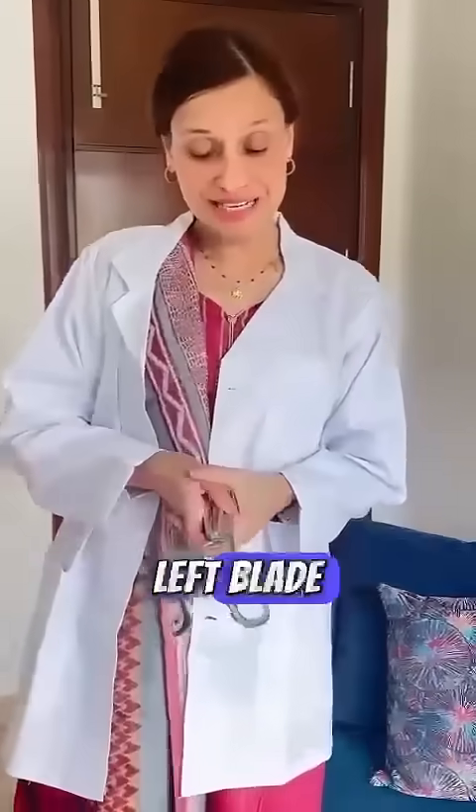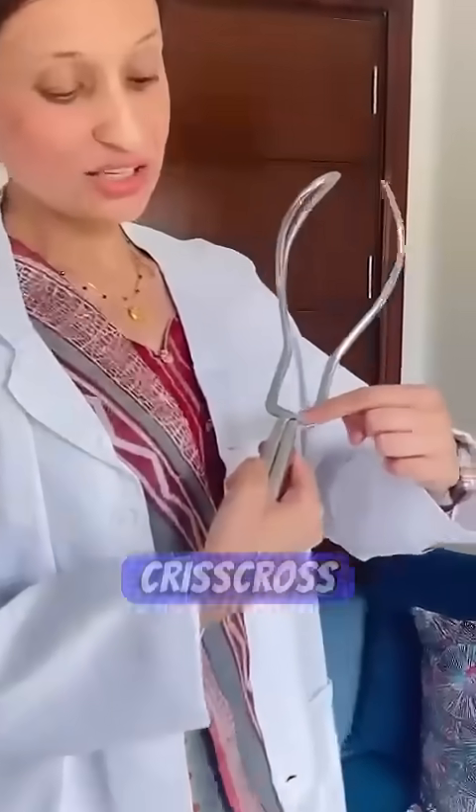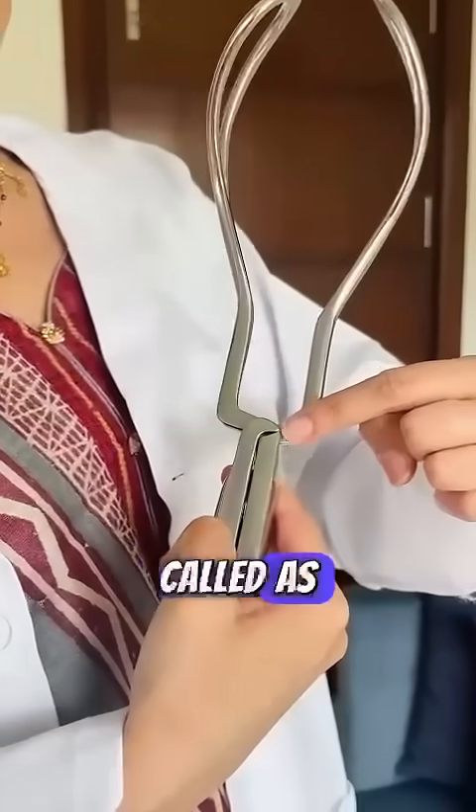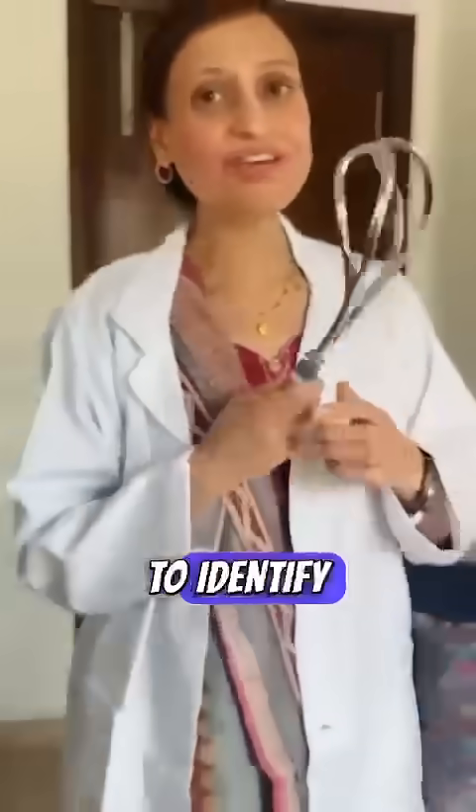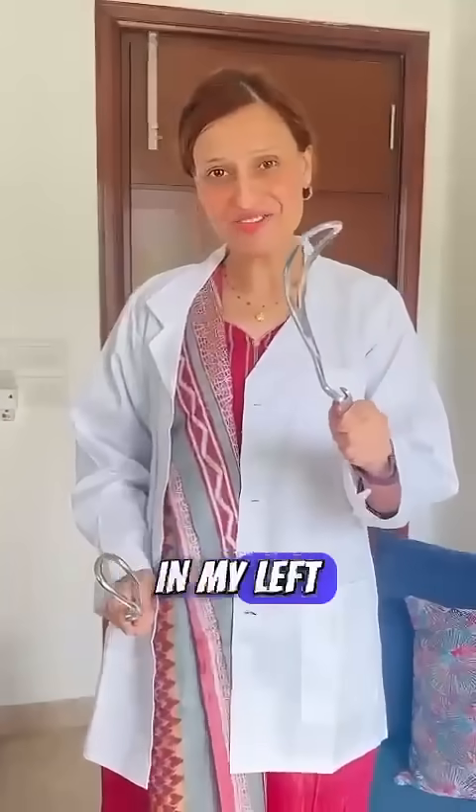Now what we need to know is, to identify which is the left blade and the right blade, we need to lock them first. Do you see the criss-cross blade? This is called the English lock, and this is what we use to identify the Wrigley's forceps. Now when I unlock them, the blade that comes in my left hand is the left blade or left Wrigley's forceps, and the one that comes in my right hand is the right Wrigley's.